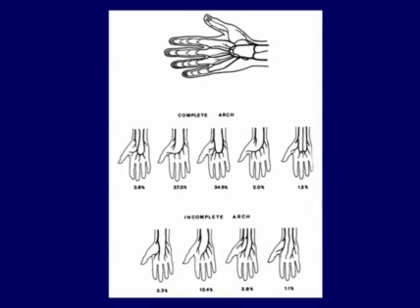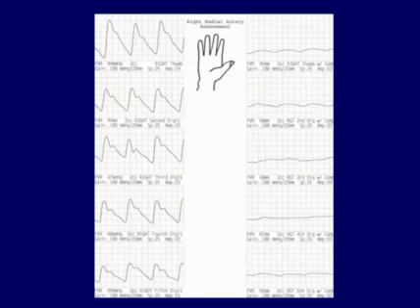Why we look at the radial artery and the ulnar artery is we want some sort of assessment of really what's going on to the perfusion to the hand, because we want to make sure that if we take that radial artery out, number one, it's a good conduit to use, but number two, that the digital perfusion will be maintained, because not everyone has a complete palmar arch. One way to test for that is with physiologic testing. Again, here's an example where it's probably better to use physiologic testing than arterial ultrasound imaging.